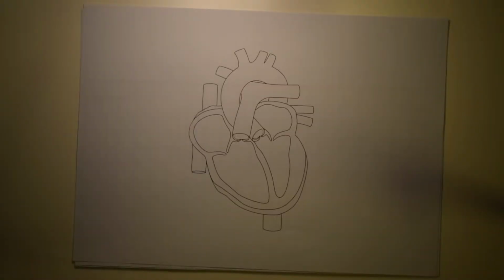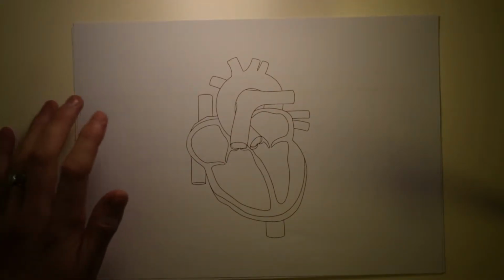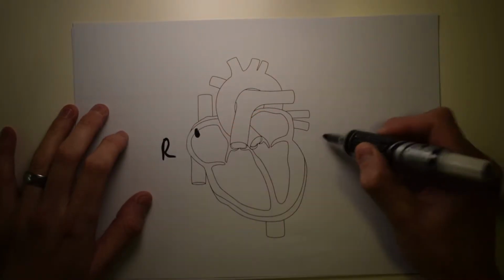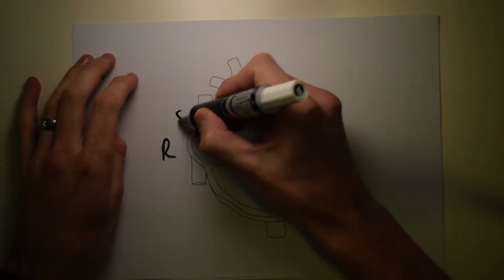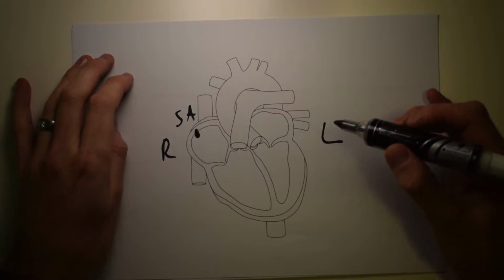We're going to be discussing ECGs. To understand an ECG, you need to understand the conduction of the heart, so that's where we're going to start. To begin, where it all begins is in the top of the atrium. This is the right hand side and this is the left hand side, because obviously it's the patient's left and right. Where it begins is in the SA node, which stands for sinoatrial node. It's not really important what it stands for, but that's where the conduction begins.